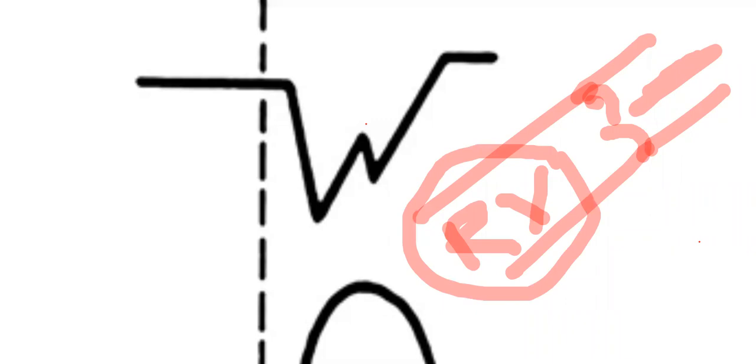So whatever flow of blood comes here, whatever the effect of the atrial contraction to cause that bulge, is counteracted or resisted by the high pressure on this side. So it doesn't bulge. High pulmonary pressure leads to resistance to bulging of the pulmonary valve. That's why you don't have the atrial dip.